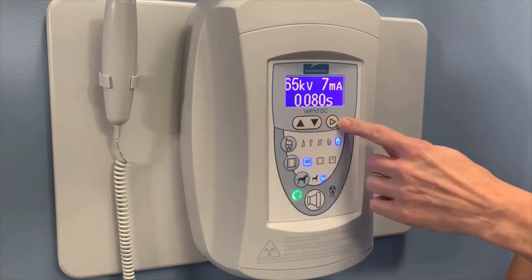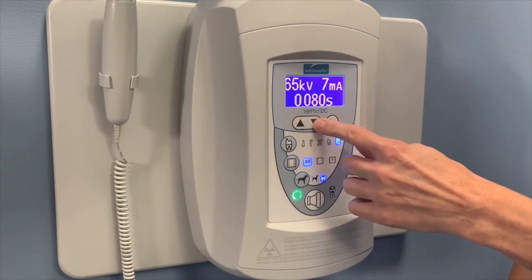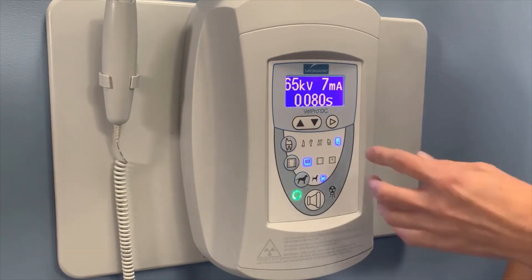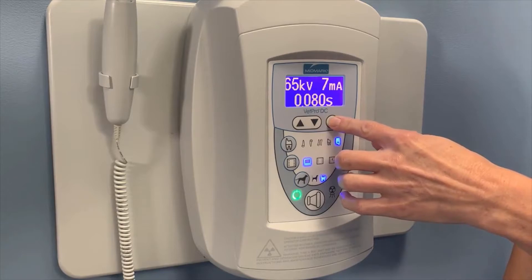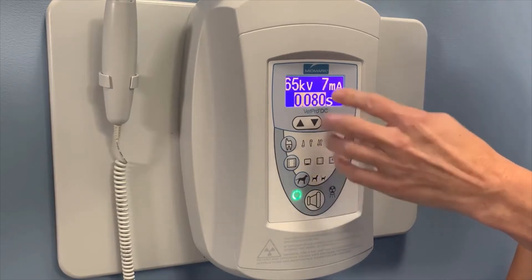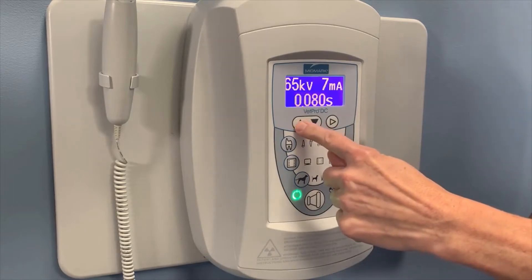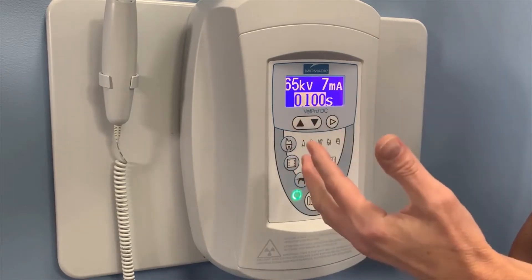Now there are several options for manual adjustments. These up or down arrows allow you to adjust the time, which will lighten or darken an image. The arrow over button will highlight one of the preset settings, and then you can manually adjust that.